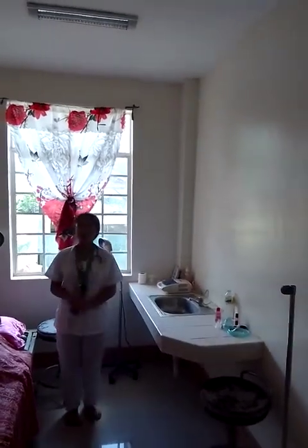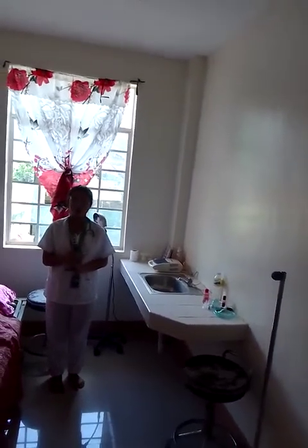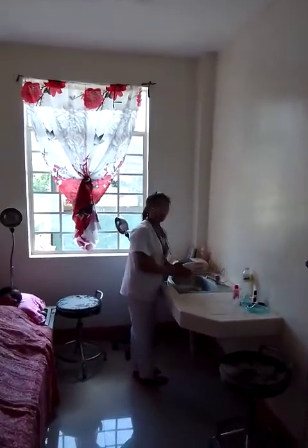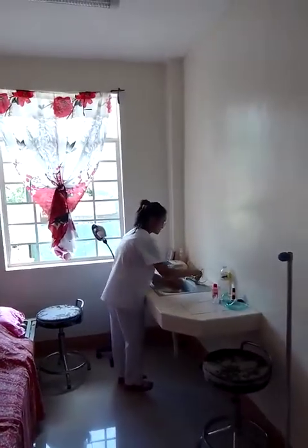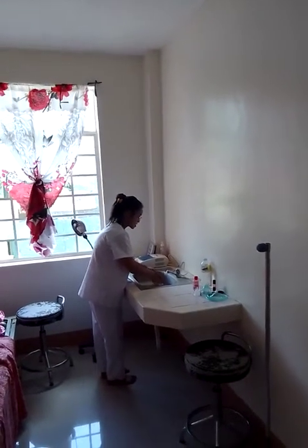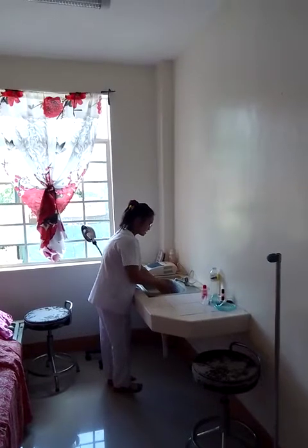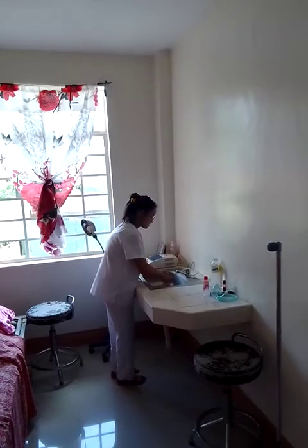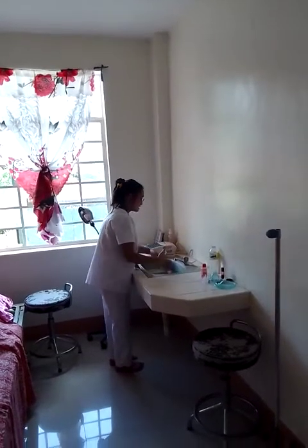Next is we need to wash our hands. In washing our hands, we need to follow the appropriate procedure of hand washing to prevent the spread of microorganisms, since we will be touching the patient.